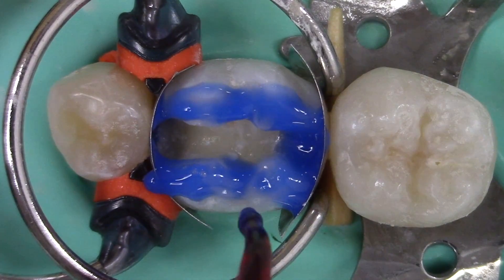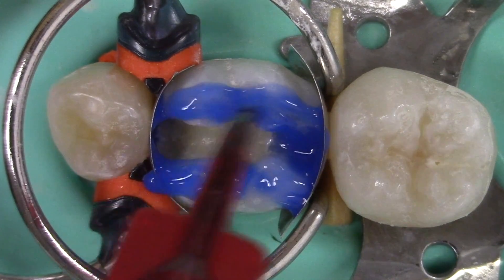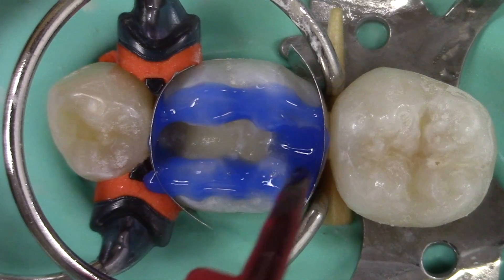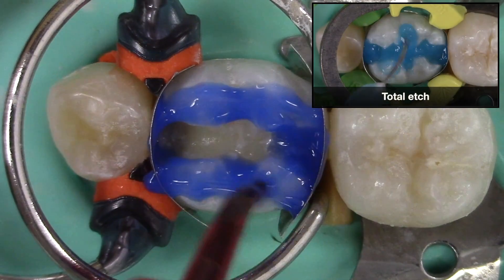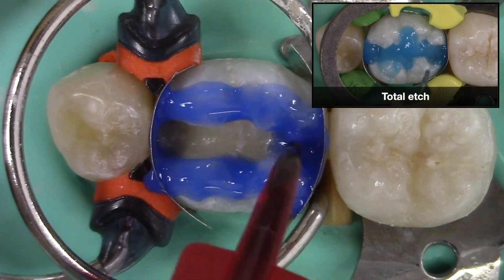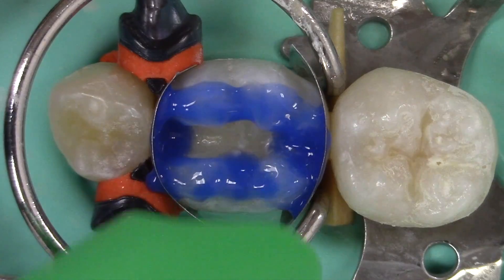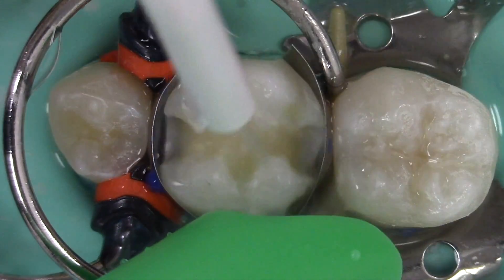The technique shown in this example is a selective etch technique, in which the etchant is applied to the enamel only for 15 seconds. If a total etch technique is used instead, the etchant would be applied to both the enamel and the dentin for 15 seconds. The etchant is completely rinsed off the tooth.